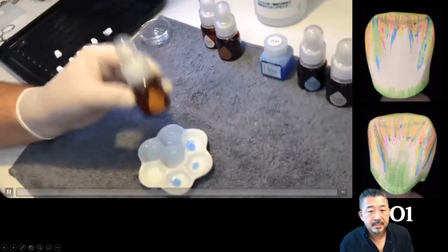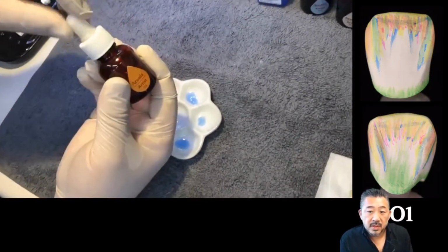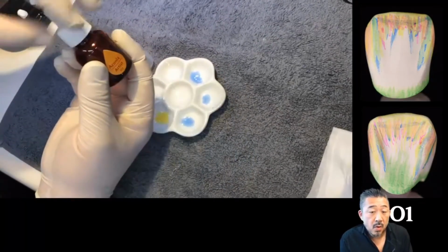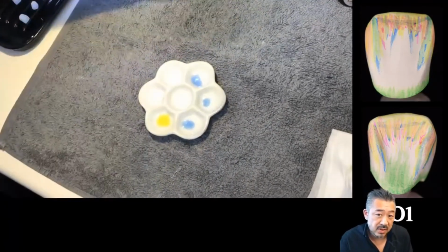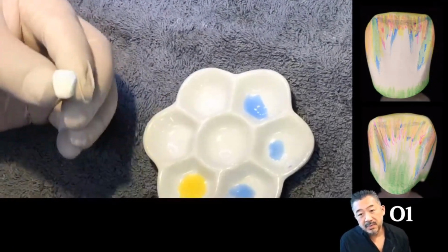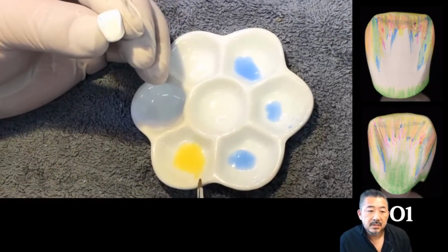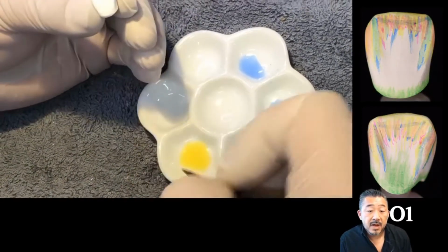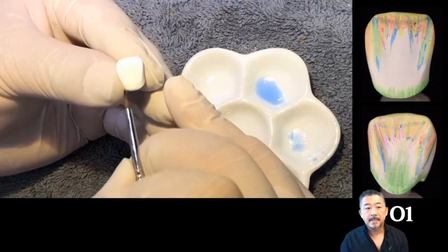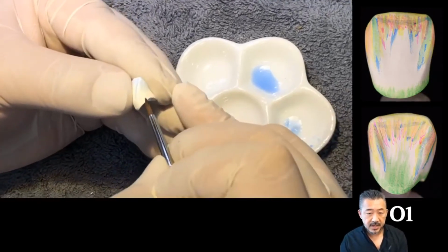Okay, from here, the steps are the same when using a TT multi-layer disc. So use 01 orange. The screen on the right is green. Remember to shake the bottle well before putting it on the palette. Then apply from about 1/3 to 1/4 on the cervical side.